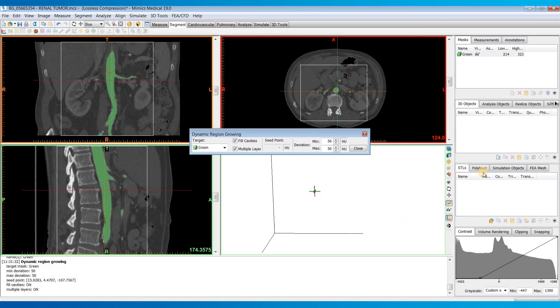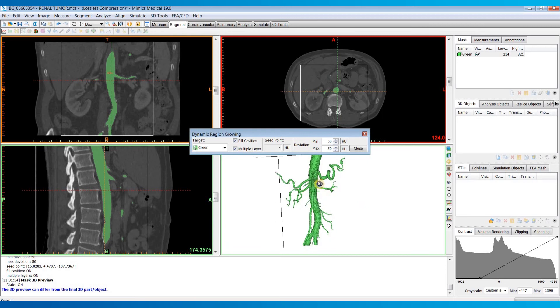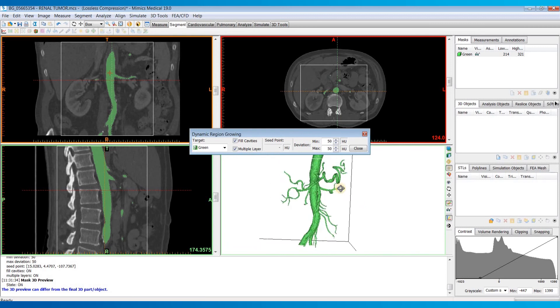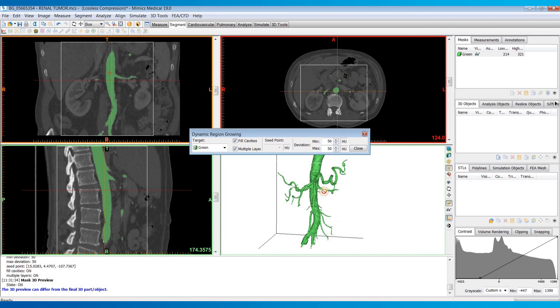And you can see if I turn on my 3D preview, one click, you get a pretty quick and easy segmentation of those blood vessels.